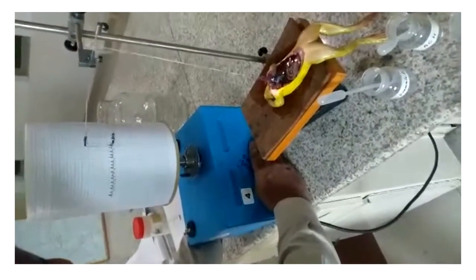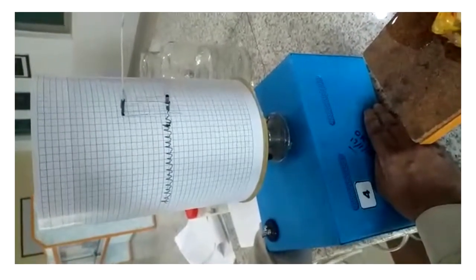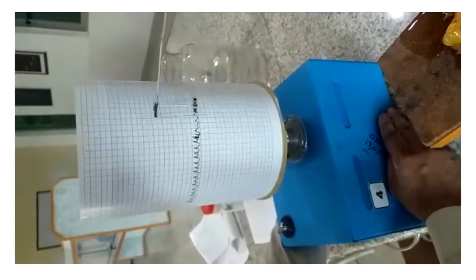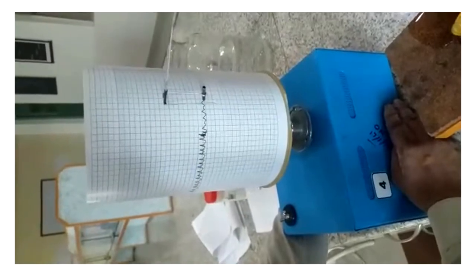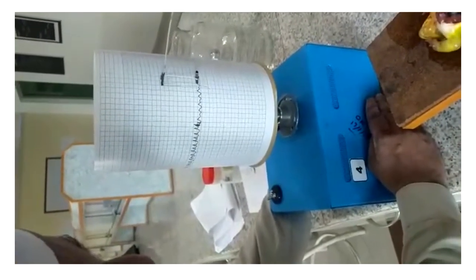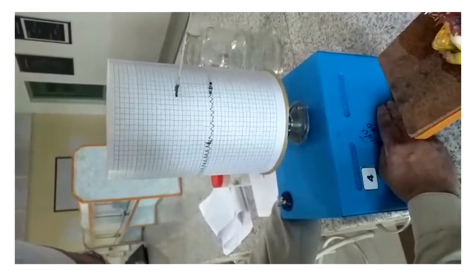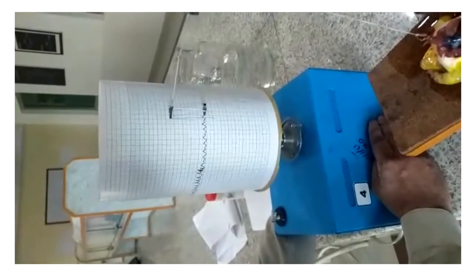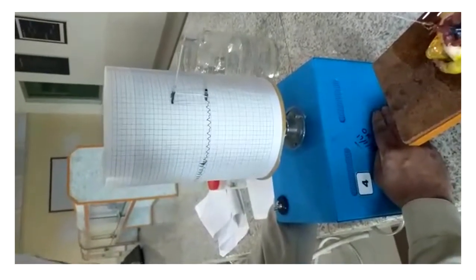Start it. You can see that there is a decrease in heart rate as well as force of contraction. Stop.